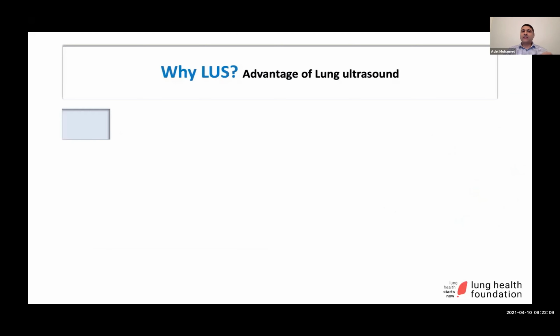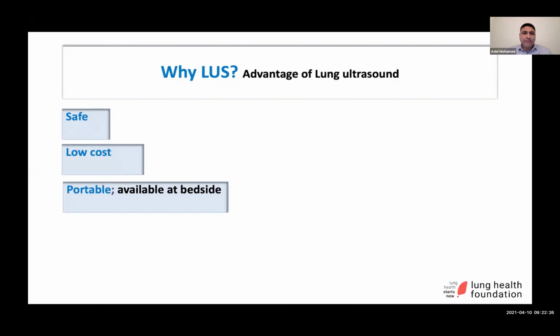So why lung ultrasound? We know that ultrasound in general, not only lung, any type of ultrasound, is a safe imaging modality compared to the other modalities, especially X-ray and CT. Ultrasound in general is low cost and portable. So this is your new stethoscope. You can carry it from bed to bed and examine your patient and assess, then go back and reassess again after you do any intervention.